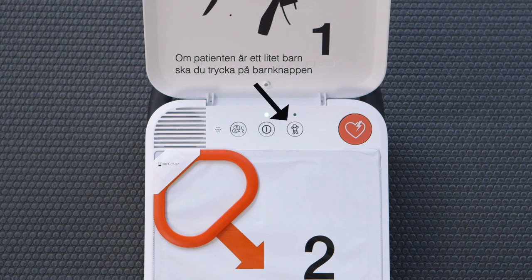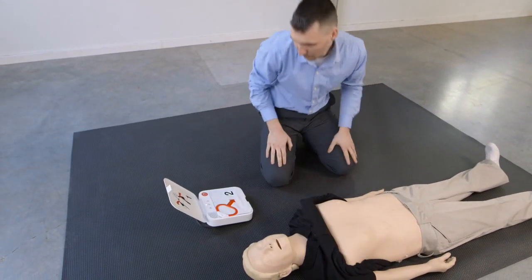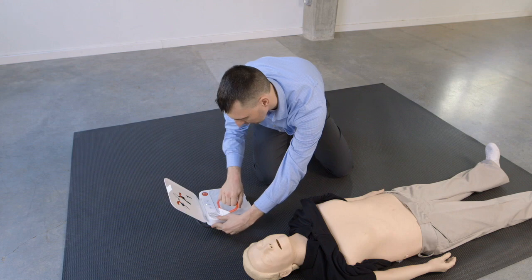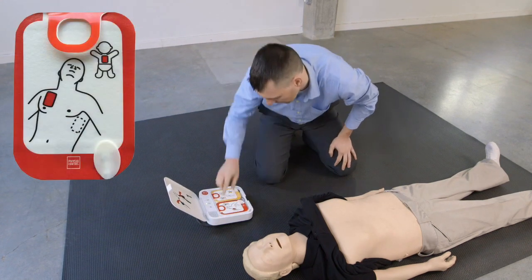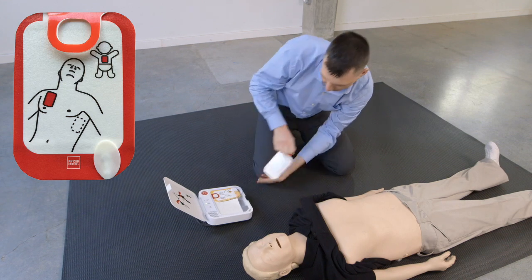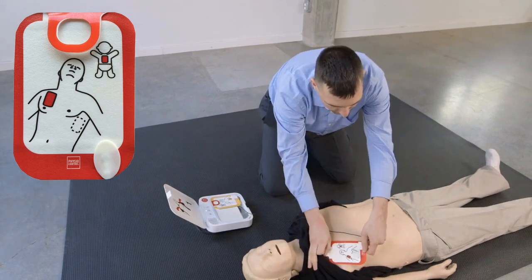Vuxenläge. Ta bort kläderna från personens bröstkorg. Dra i det röda handtaget för att frigöra elektroderna. Se på bilderna på elektroderna. Sätt fast elektroderna på barhud, precis så som det visas på bilderna. Tryck fast elektroderna ordentligt.